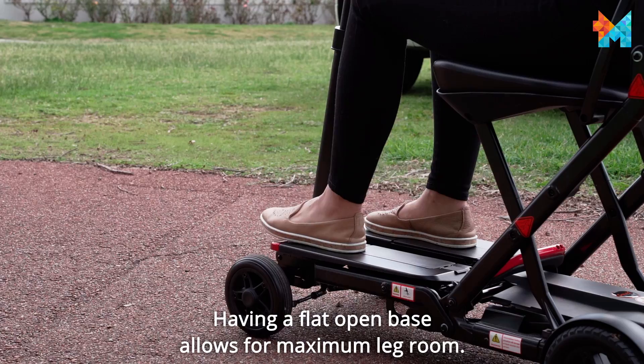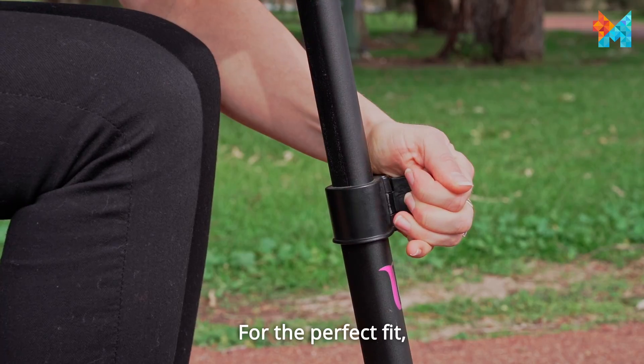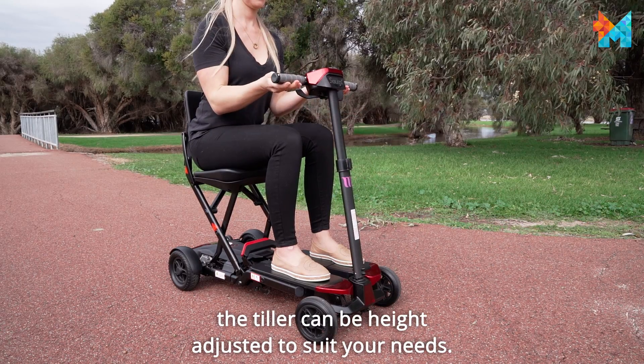Having a flat open base allows for maximum leg room. For the perfect fit, the tiller can be height adjusted to suit your needs.